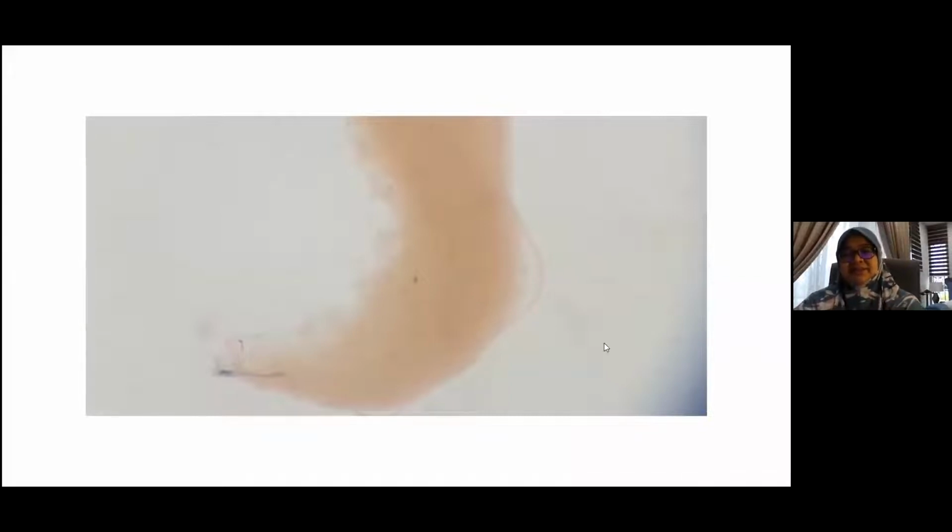The sections need to be cut into 1 millimeter tissue sections. And this is an example of a tissue that I see directly under the dissecting microscope. I'm not sure whether you can see; you have to pull your head back from the monitor. Can you see these balls here? These fine capillary balls are your gloms.